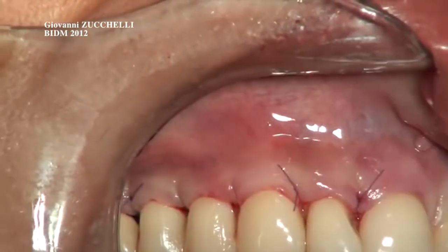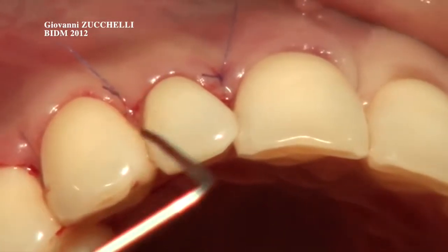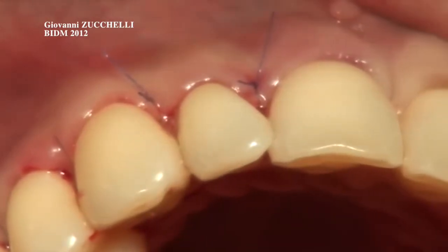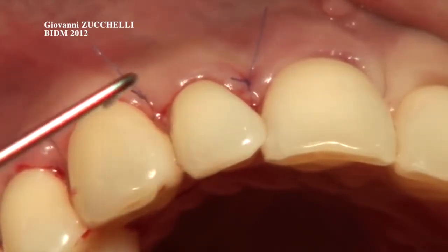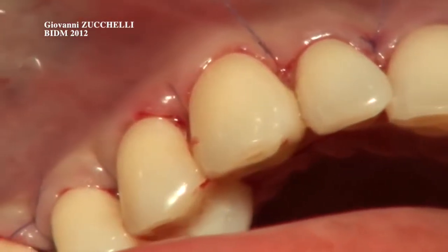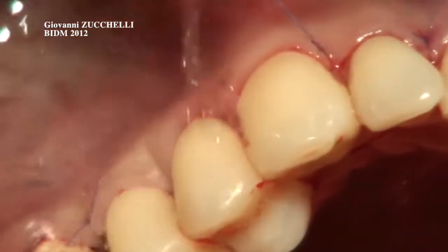Now I want to show you the occlusal aspect. Okay, you see that there is no space for the blood clot because there is a real tight adaptation between the keratinized tissue and the convexity of the clinical crown on all teeth. Open a bit. Of all teeth included in the flap.